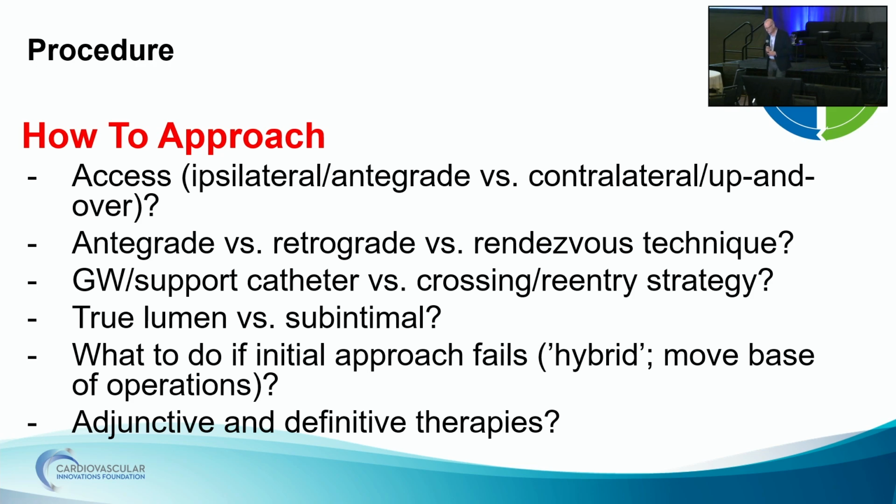I would definitely try just slightly, maybe an 014 pilot wire, some CTO wire, and then work my way. And if you can get in, awesome. If you can't, because sometimes it just flies down, and then you've got to worry about thrombus.